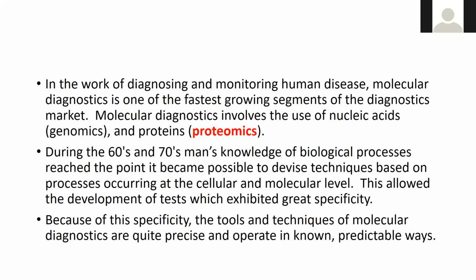We can do proteomics. One of our best micro machines is called MALDI, and it bases on the protein pattern of the bacteria. That's how it IDs. So it doesn't need the genetic material. It may just look at the protein pattern, and it has 100 different protein patterns, because every different bacteria has a different one. Then the machine just picks up your sample, IDs that protein pattern, and will tell you what you have. So MALDI is really quick about telling you what you have.